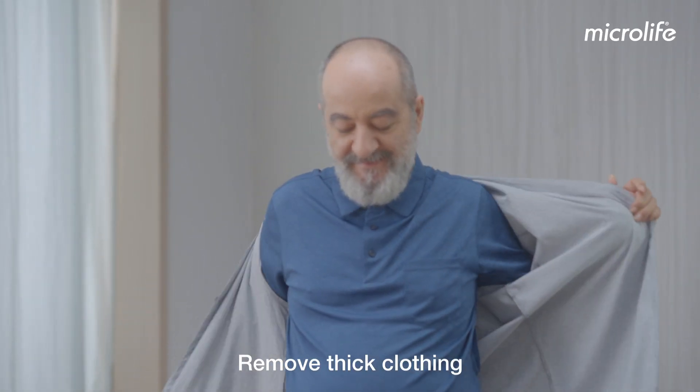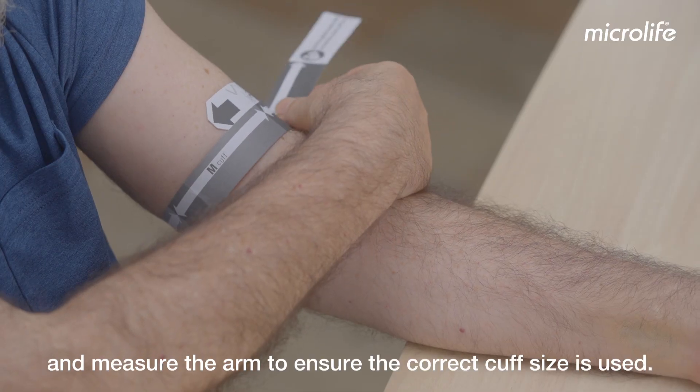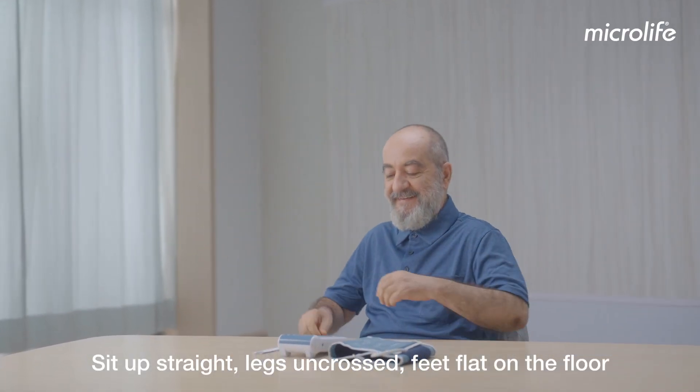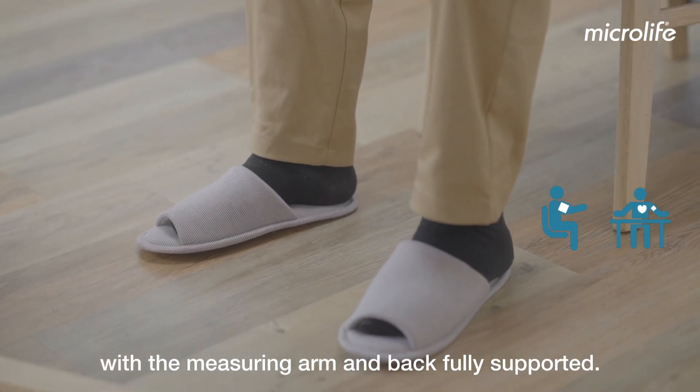Remove thick clothing and measure the arm to ensure the correct cuff size is used. Sit up straight, legs uncrossed, feet flat on the floor with the measuring arm and back fully supported.